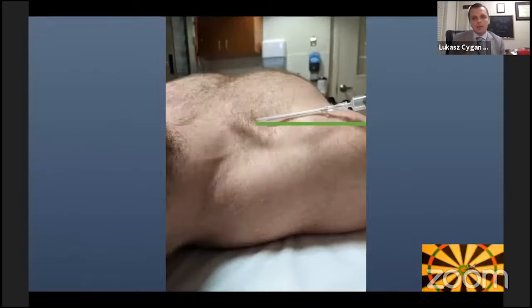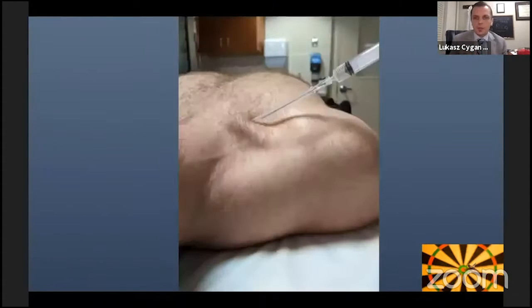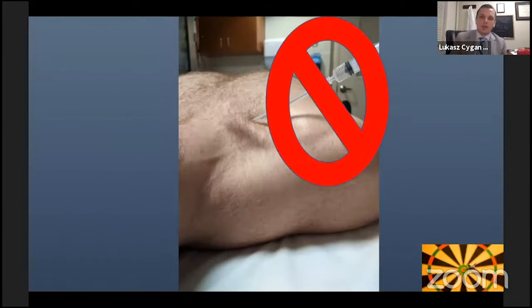And I understand undoubtedly that the humeral head is going to get in the way, but you want to get as close to a 0-degree angle as possible. You'll use your thumb to push the needle underneath the clavicle so it walks underneath, and you aim towards the suprasternal notch. Whenever I see a resident increase that angle, the procedure should probably be abandoned because of the increased risk of pneumothorax and bleeding as well.